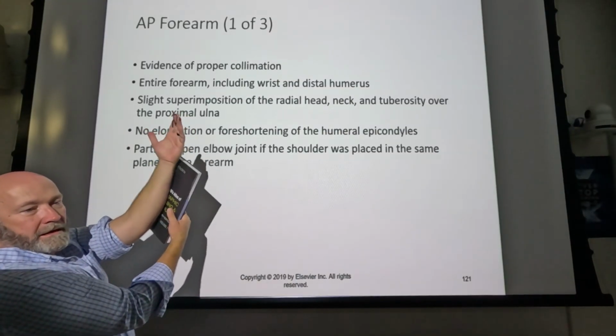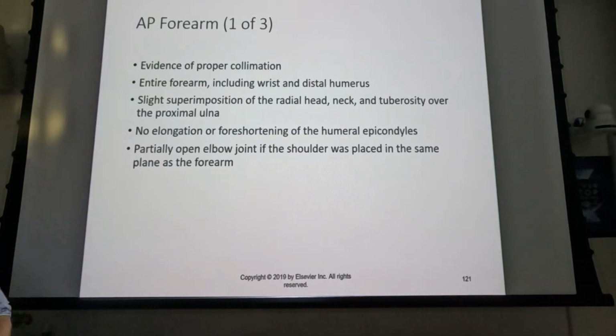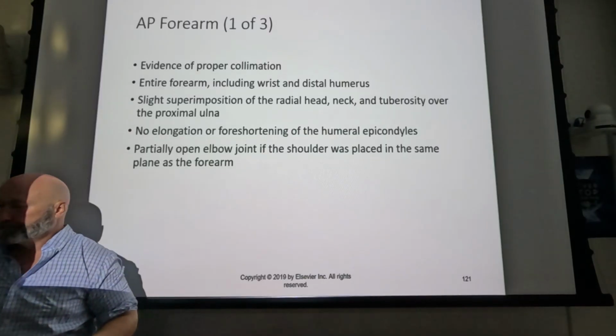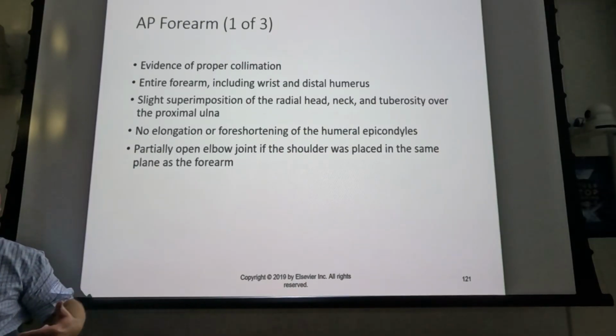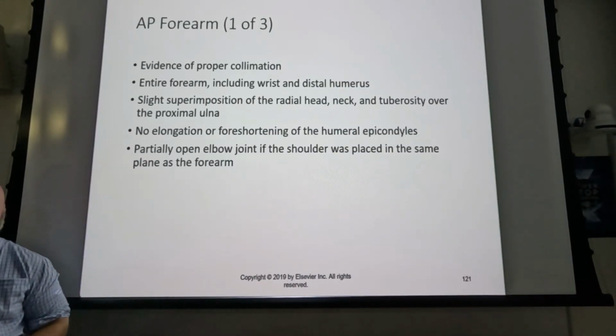Yeah. Okay, so this applies to 3 different bones or exams. So humerus, to a lesser degree the forearm, but I guess 3, and then the tib fib. And I'll tell you why it doesn't really apply to the femur whenever we get into lower extremity.